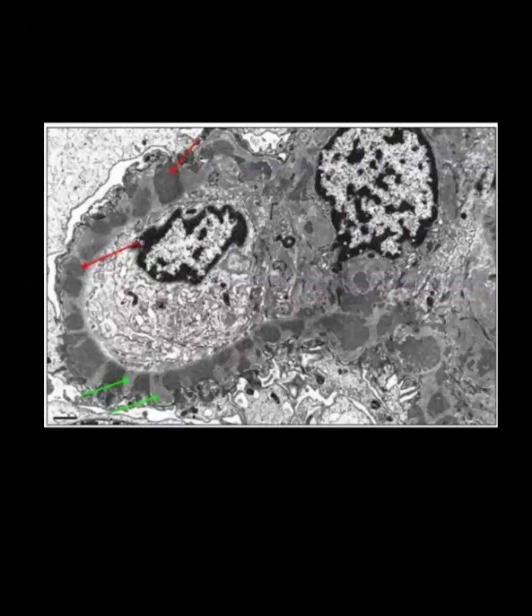Dr. Akil, can you tell me the difference between primary membranous versus secondary membranous? Okay, in primary membranous, usually we find fine granular IgG4 deposits, while in secondary membranous we find IgG1, IgG2, and IgG3.